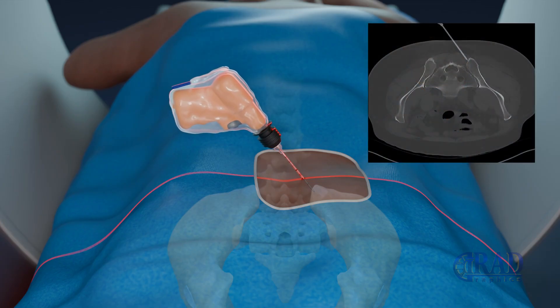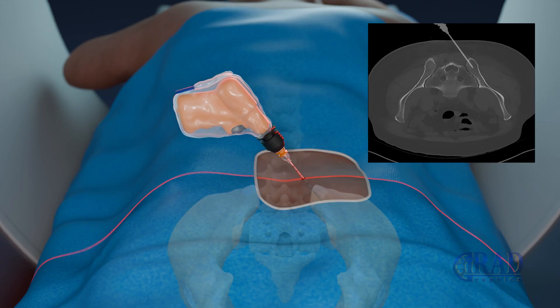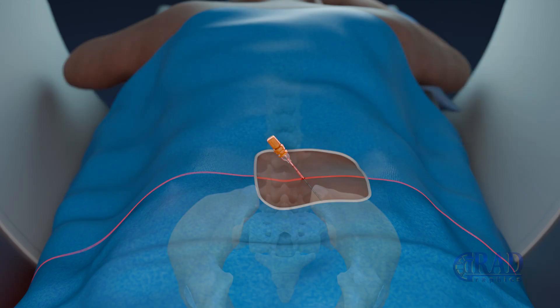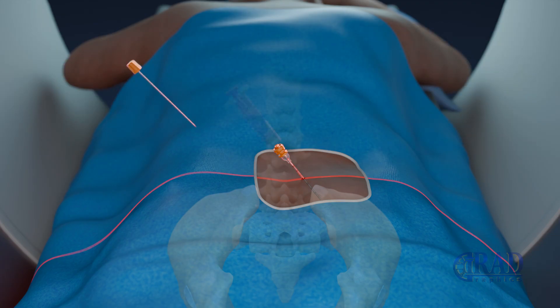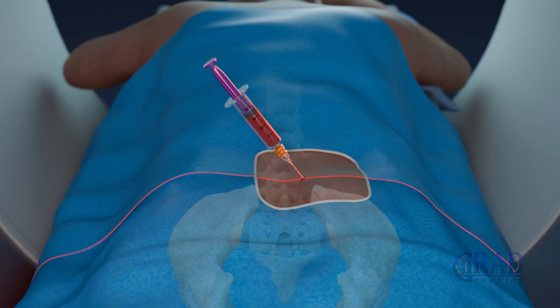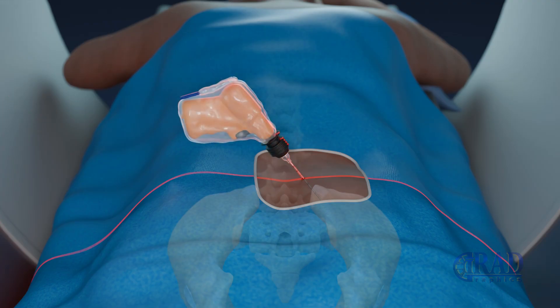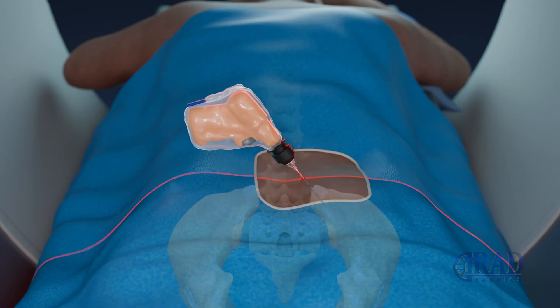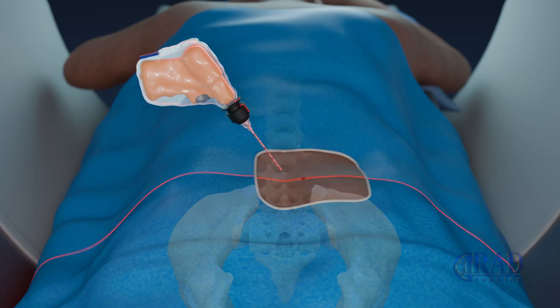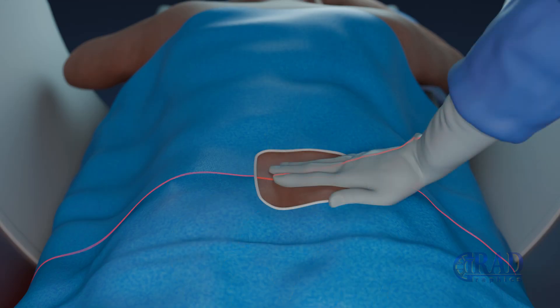Serial scans are used to confirm the position of the needle tip as it enters the cortical bone. Similar to the fluoroscopic technique, bone marrow aspiration is performed, followed by obtaining a core tissue sample. Once the sample is collected, the needle is carefully removed and the biopsy site is compressed to control bleeding.